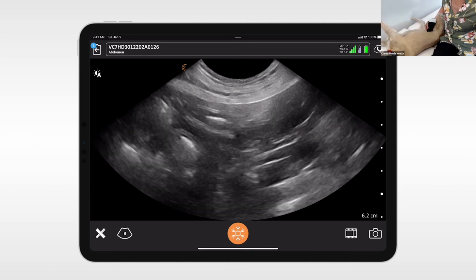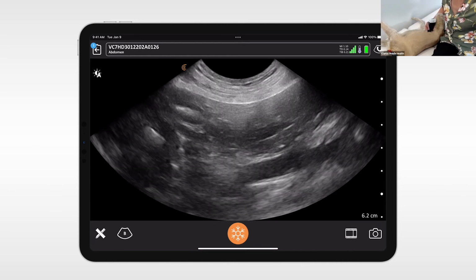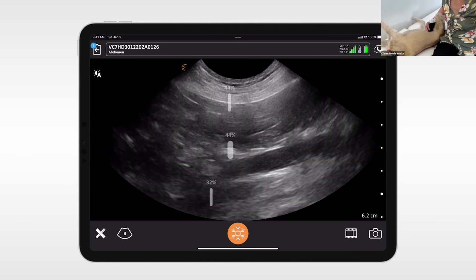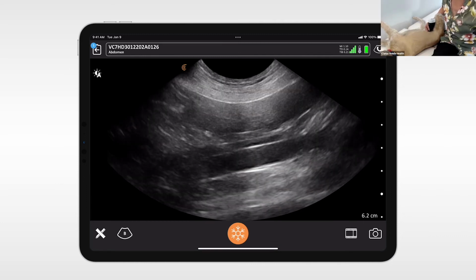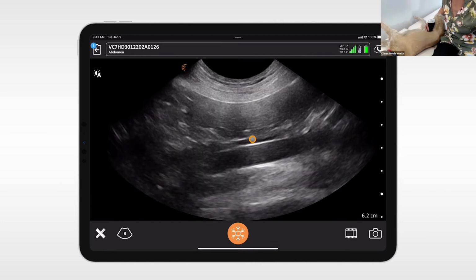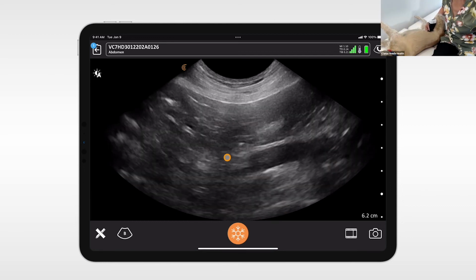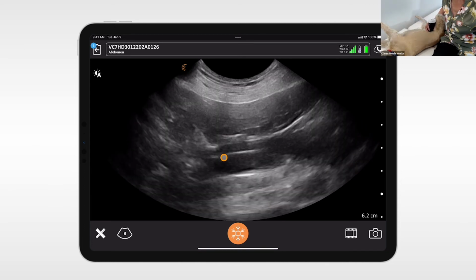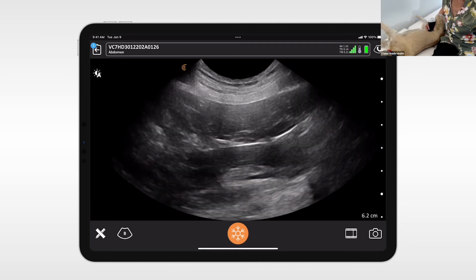So on the right hand side, it's very similar. We just have to be careful that we've got the aorta and not the caudal vena cava that we're following. Okay. Oh, I see. So the vena cava is on top. It is on top, and you can play around with the pressure there as well, because the pressure will compress the caudal vena cava, but you won't be able to compress the aorta.